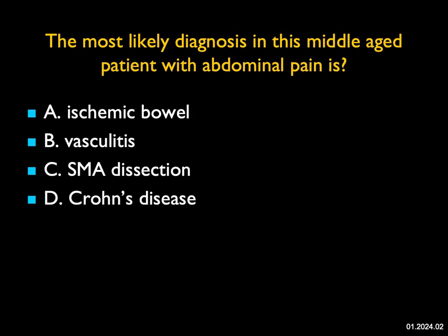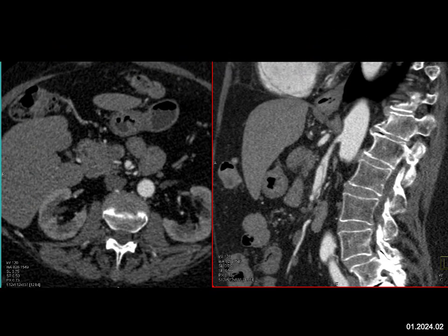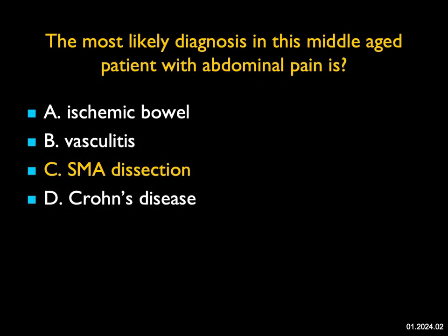The most likely diagnosis in this middle-aged patient with abdominal pain is? We look at the images and you can see the bowel looks okay. Kidneys, as visualized, look okay, as does the liver. But when you look at the axial views, there's a linear line through the SMA, which is better seen on the sagittal views — that's a dissection of the patient's SMA. I don't see ischemic bowel. There are a number of causes for SMA dissection, from trauma to procedures to vasculitis, including fibromuscular dysplasia and SAM. The best diagnosis in this case is SMA dissection. A really nice example.